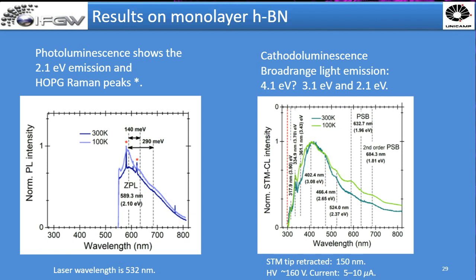From the modeling point of view, we can model the mirror and the optics that we have to work out on paper what the light collection efficiency should be, supposing that everything is working as it should. This is what gives the number of 72%, but there's always a question of how reliable this number is.